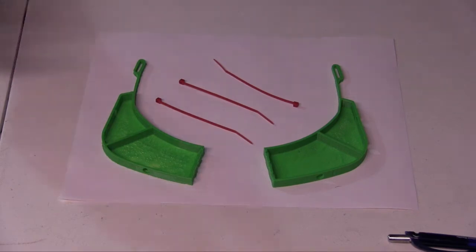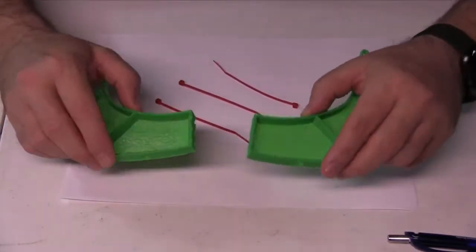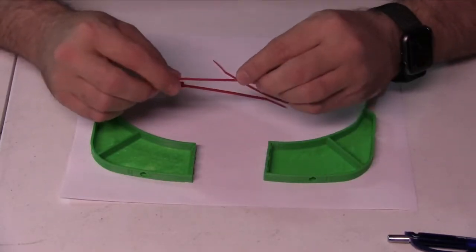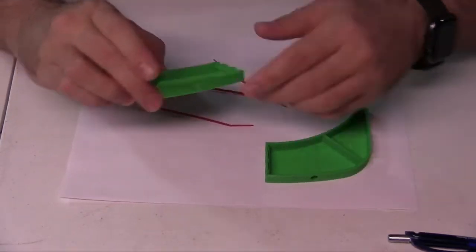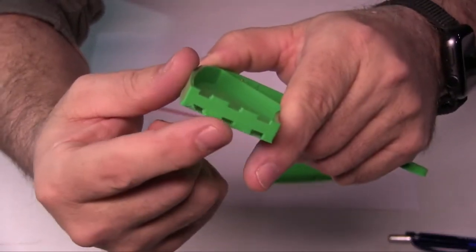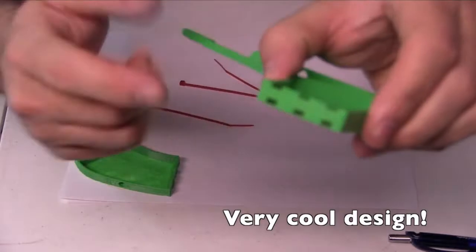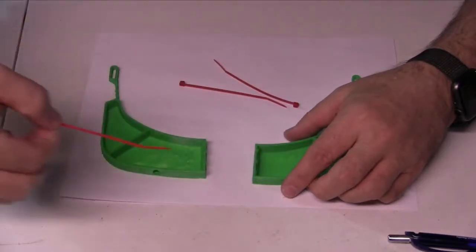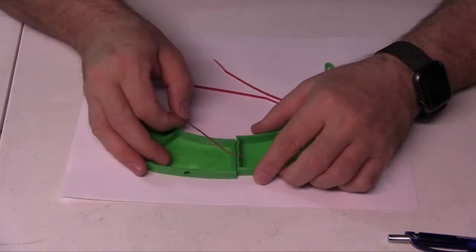Okay, what we have here is the two 3D printed pieces, and we have three small zip ties. And the engineering of these particular 3D prints is that there are holes that exist along the bottom frame here that match up with the holes on the other side. So we are going to be placing the zip ties through those holes, making a connection from this side to the next side. So you put them together.